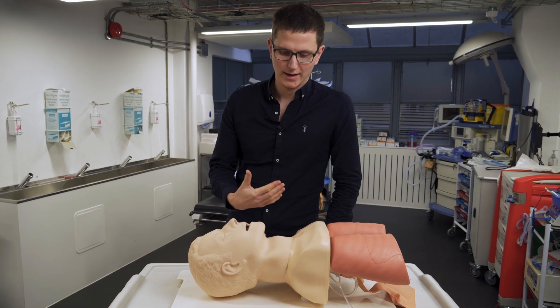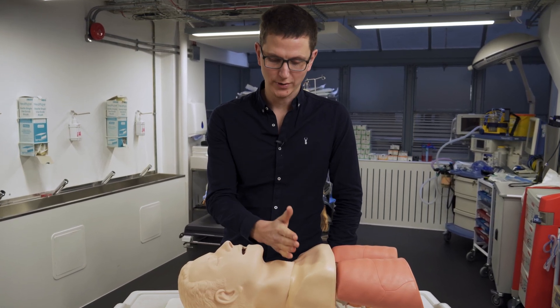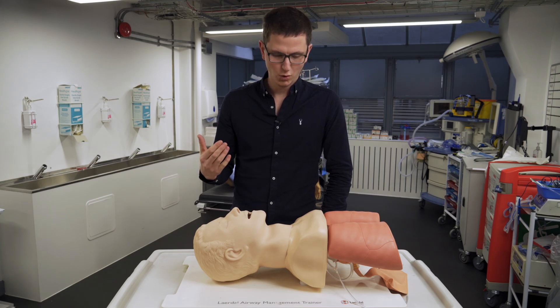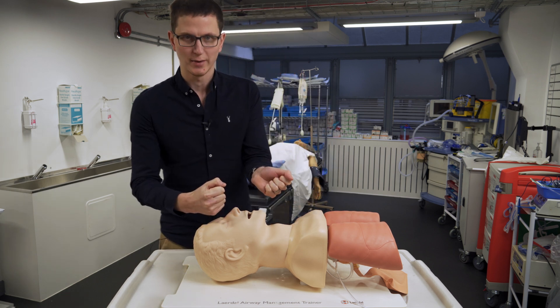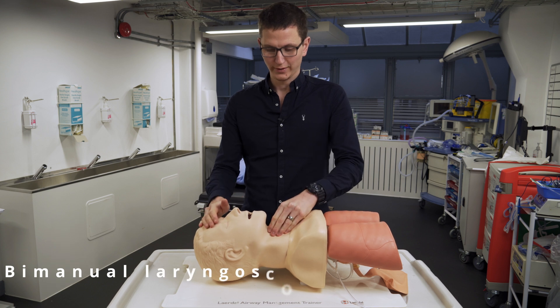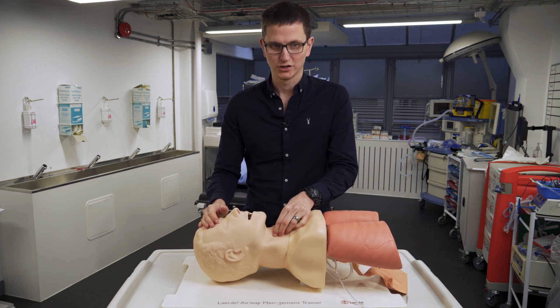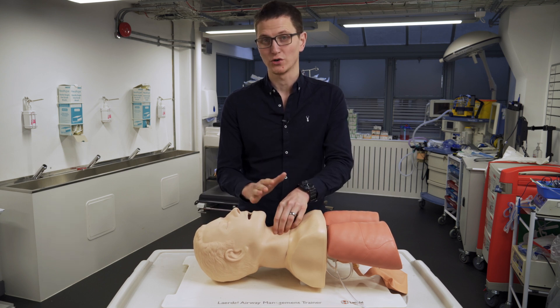Ideally, and I actually read this evidence — it's quite interesting — they say that when doing ELM, you should be standing on the right-hand side of the patient, as it is more effective. What actually works best is that the person who is intubating takes someone else's hand and moves it, guiding it to the right position, then tells them where to stop and hold — because they can't see what you can see.